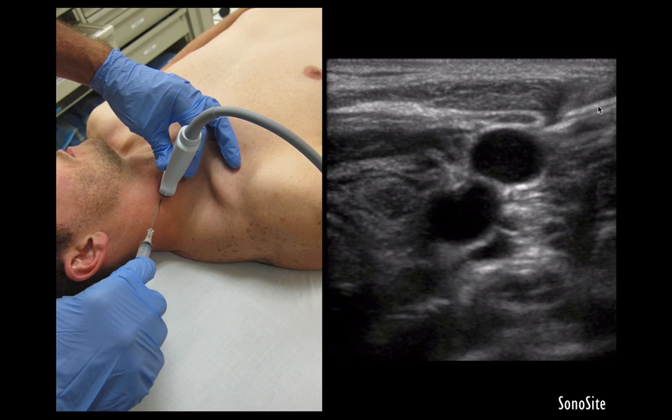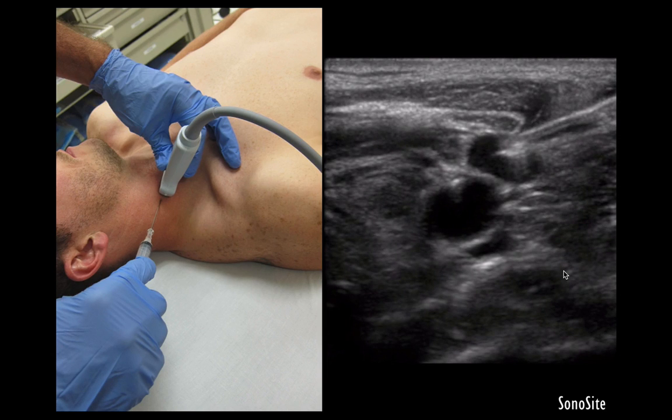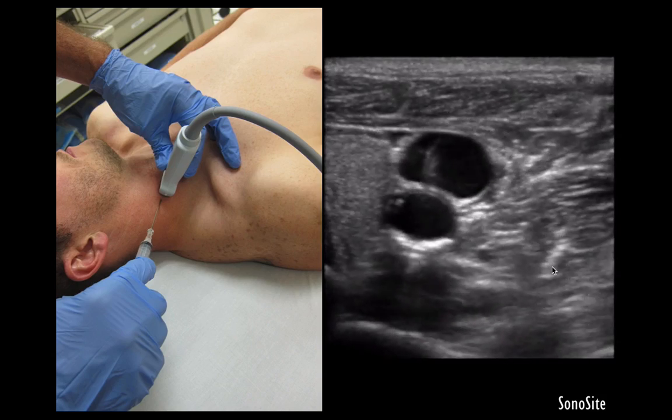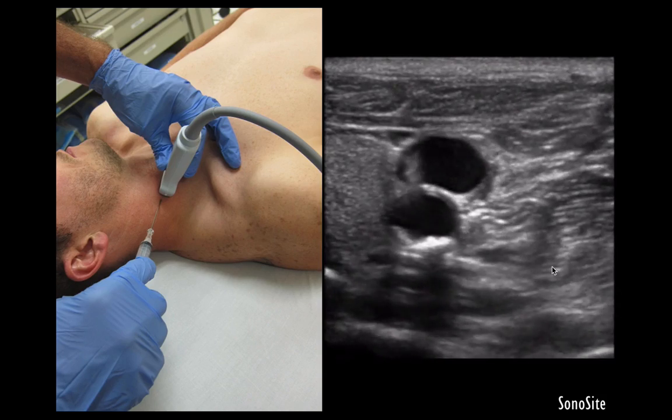visualizing the needle right here all the way as it comes into the IJ and punctures it. The beauty of this is if he goes through, he won't hit the carotid. If he were to come up from down to top, he may have hit the carotid artery. This is a nice technique, threads the wire, and is done, which is a nice little trick.